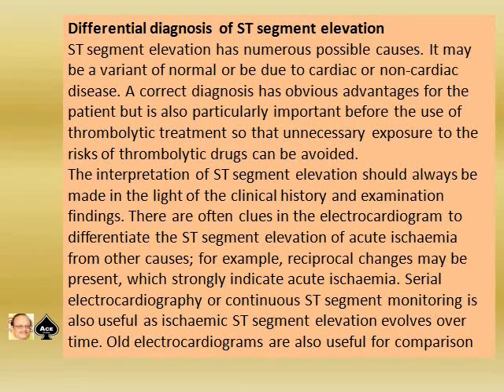Differential diagnosis of ST segment elevation. ST segment elevation has numerous possible causes. It may be a variant of normal or may be due to cardiac or non-cardiac disease. A correct diagnosis has obvious advantages for the patient but is also particularly important before the use of thrombolytic treatments so that unnecessary exposure to the risk of thrombolytic drugs can be avoided.